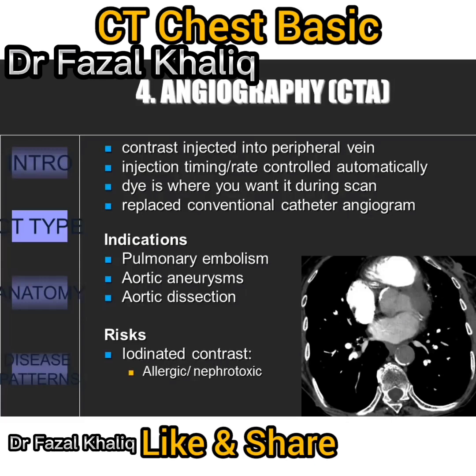In PE, to accurately check for a filling defect, the scan is timed such that the contrast is in the pulmonary artery during the scan. The risks associated with CTA often involve the iodinated contrast and are allergic reaction to the dye and nephrotoxicity.